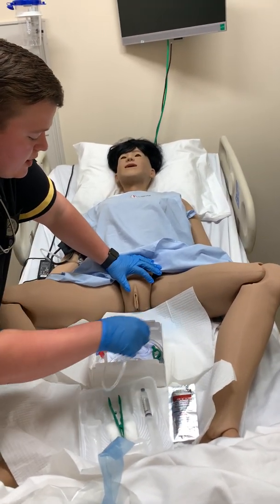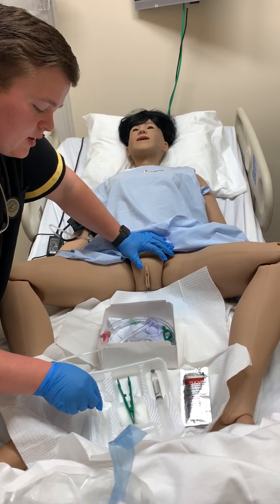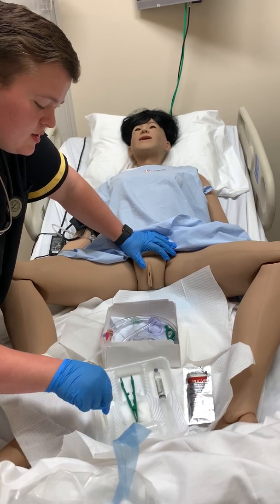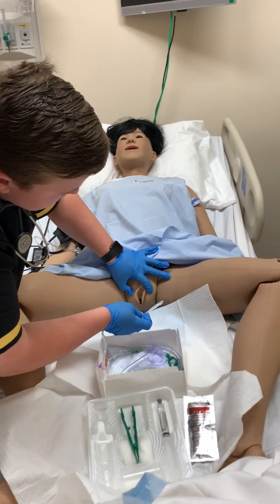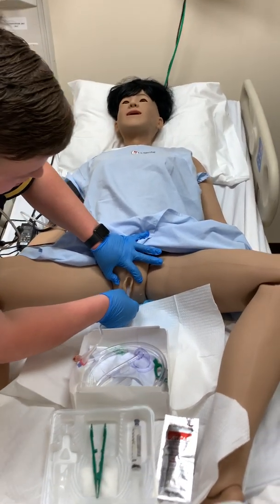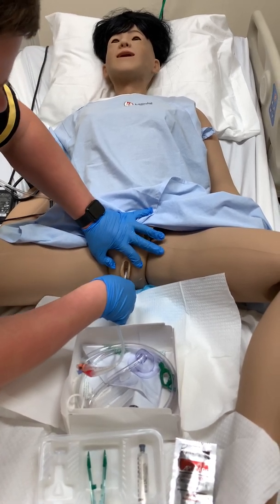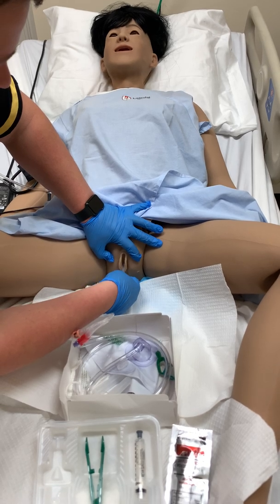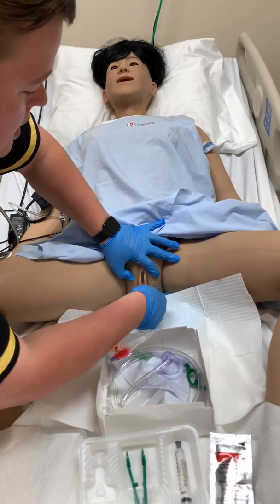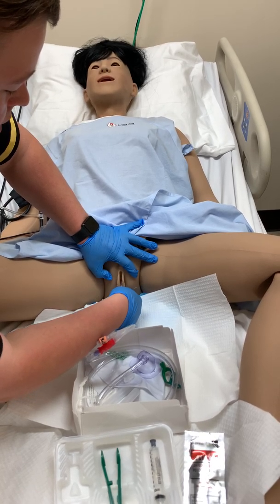So then we're going to go ahead and get our tip lubed up so that it will be easier to insert. We will go ahead and spread the labia and insert the catheter. So what you're going to do on a female patient is insert the catheter until you start to see urine go down the line.